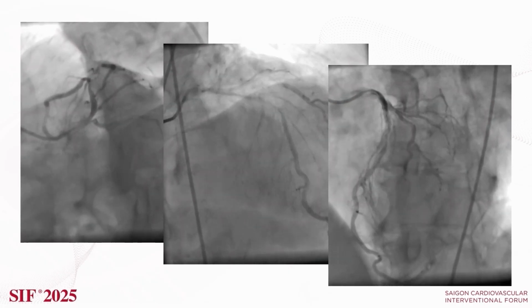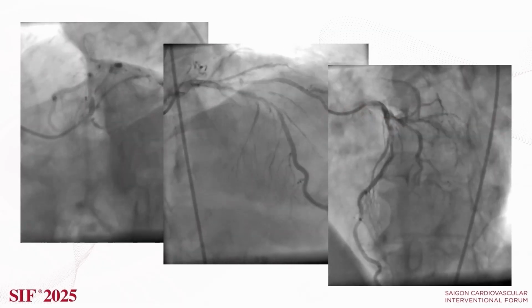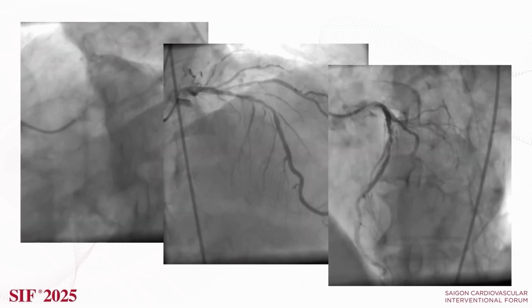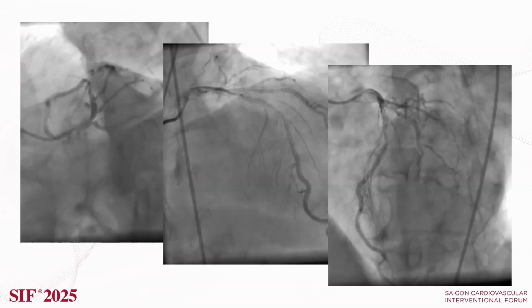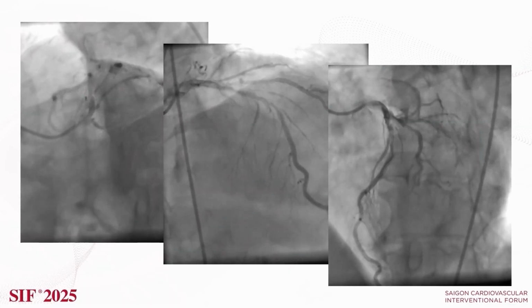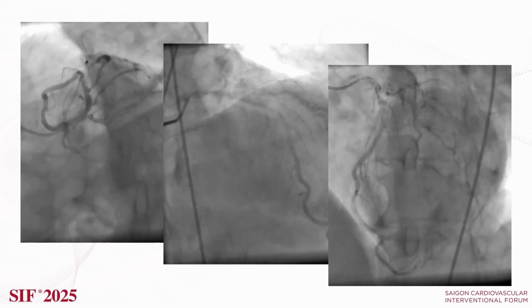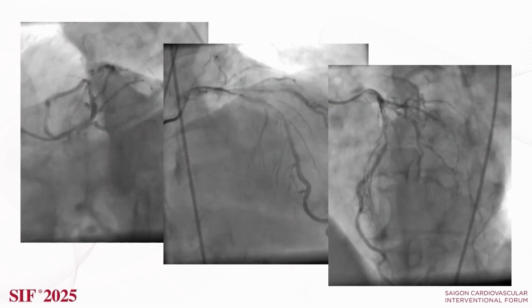So image-guided PCI of the LAD, likely with atherectomy, and ostial circumflex. I wouldn't stent this, but finish with a DCB if I have a possible debulking result. So the question here is, do you prepare a backup for the circumflex PCI, or do you just ignore the circumflex? No, I would go for the circumflex as well.